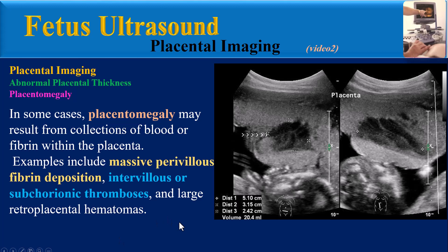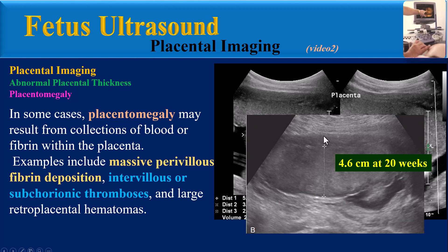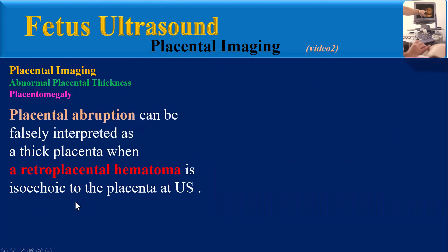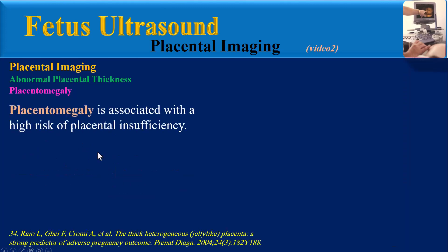Examples of fibrin deposition causing placentomegaly include massive perivillous fibrin deposition, intervillous or subchorionic thrombosis, and large retroplacental hematomas. In this ultrasound image, the placental thickness measured about 4.6 cm at 20 weeks gestation; oligohydramnios was also present and the maternal serum alpha-fetoprotein level exceeded 18 MoM. Pathologic examination following delivery confirmed a large intervillous thrombus. Placental abruption can be falsely interpreted as a thick placenta when a retroplacental hematoma is isoechoic to the placenta at ultrasound.